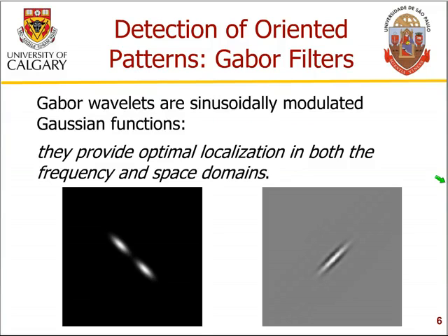Now, our aim was to detect the vertebral plateaus automatically by using image processing techniques. And we are going to present some initial results that we have obtained for this purpose. We could possibly detect edges of vertebral bodies using edge detectors such as Sobel detectors or Canny operators that are commonly used in image processing. But it would be efficient to use filters that can be tuned to multiple directions. And Gabor filters offer the best option in terms of detection of edges or oriented features at all angles.